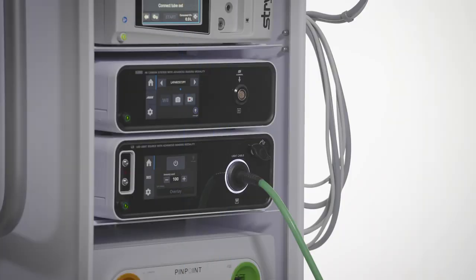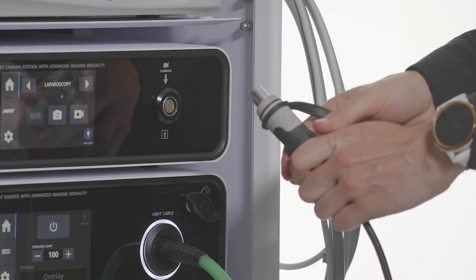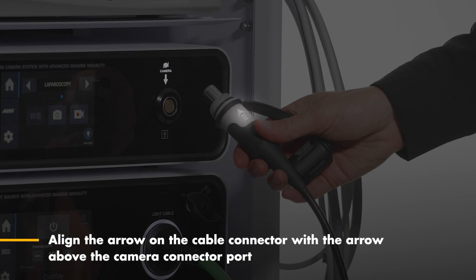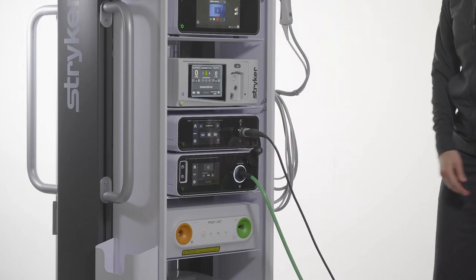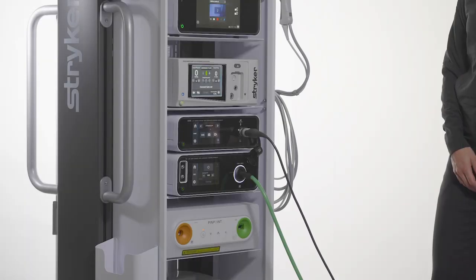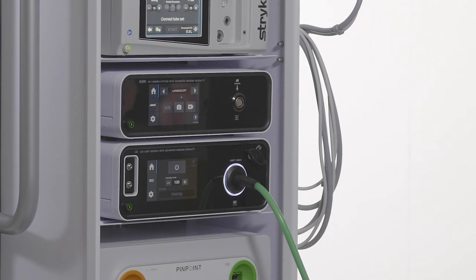To connect the camera head to the camera control unit, unscrew the soaking cap to reveal the cable connector. Orient the camera cable by aligning the cable arrow to the arrow above the camera port. Insert the cable into the port fully. Properly disconnect the camera cable by grasping the connector and not the camera cable itself.